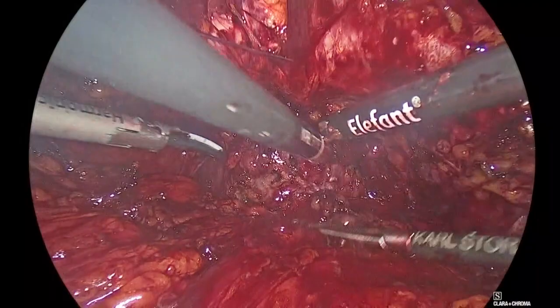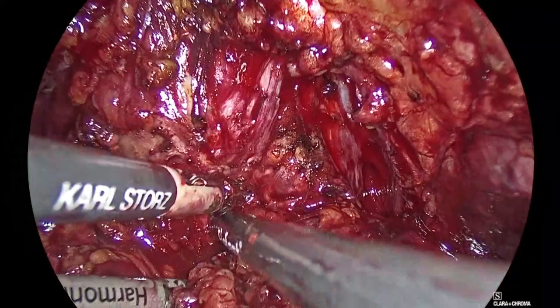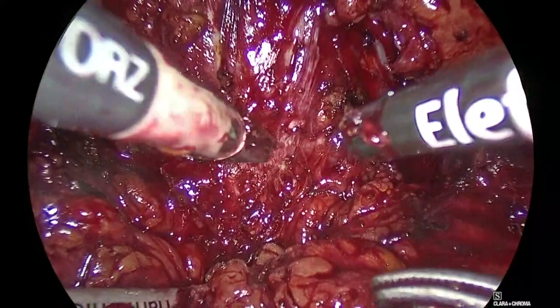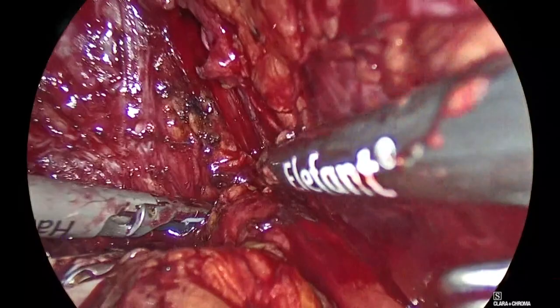Panagiotis, leave the grasper. Come in, rotate, Padeli. Rotate to the right, Padeli. To the right. There, correct. Good. So it's clearly stuck here too, huh? Blunt dissection. Good, there. Padeli, to the right. So we saw our margin of the prostate here, all this tissue, and actually go. Good.